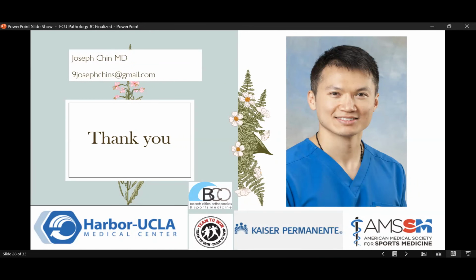Yeah, thanks, Doug. I think you highlighted one of the things that I really wanted to drive home with the ECU. When we're scanning this, it is normal for it not to be normal, and that's my baseline assumption when I scan someone for an ECU-related problem. I would be surprised if someone has ulnar-sided wrist pain and doesn't have some ECU pathology.